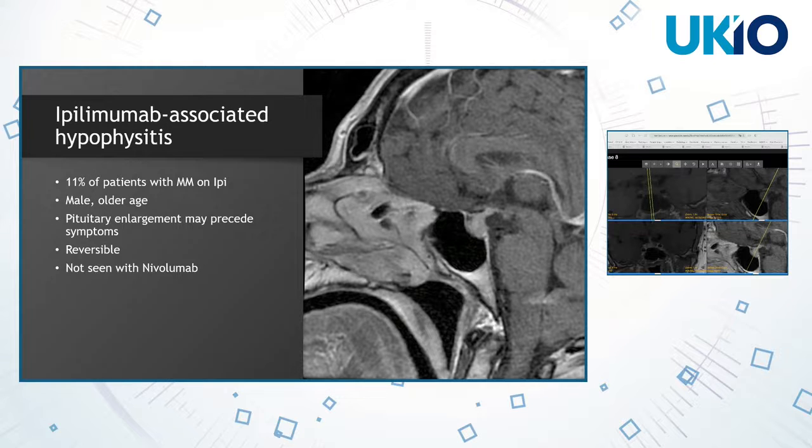So it's an important review area, particularly for your follow-up of patients with metastatic disease, which we see a lot more with melanoma and renal cell cancer, the surveillance staging scans. So ipilimumab-associated hypophysitis, seen occasionally. Okay, so that was our last case. Thank you, everyone, for taking part.